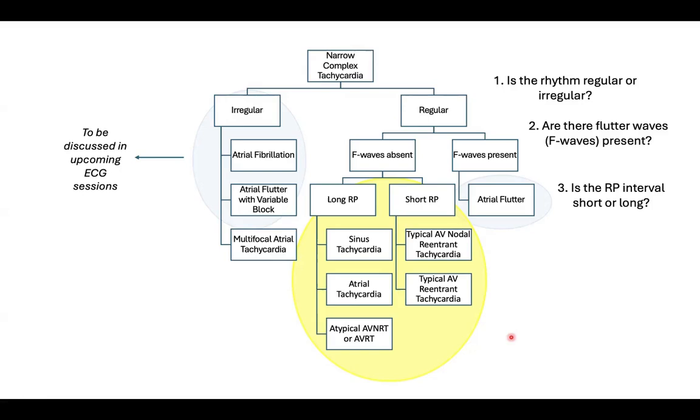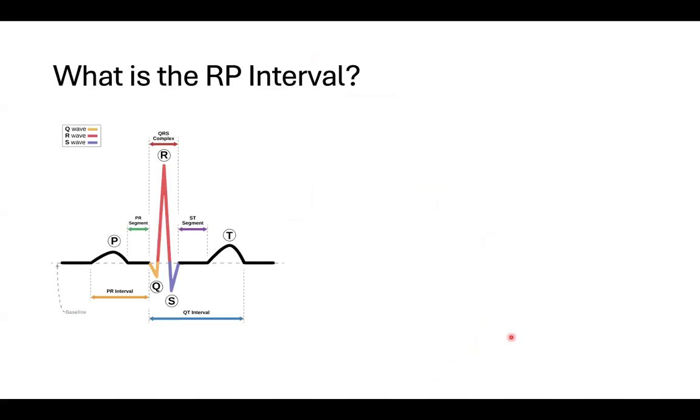Awesome. Yeah, that's super helpful to help frame why they are regular and how we can think about these as we go through them. So getting into the RP interval, I think this was something that was a little bit more new to me as I got further along into residency. But here we have just an image of the PQRST complex, which is a callback from Tuba's initial EKG basics session, where she walked us through the various segments of this.